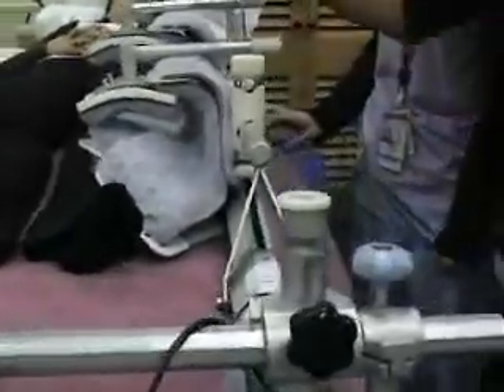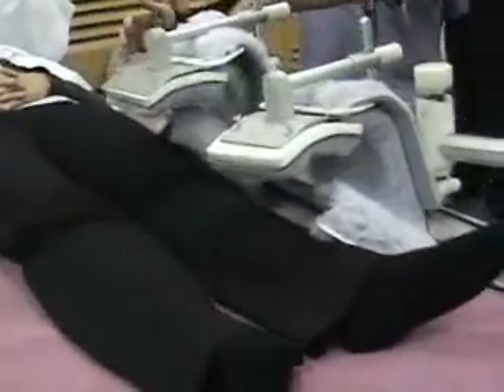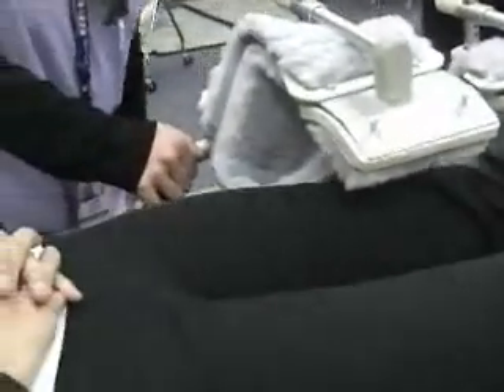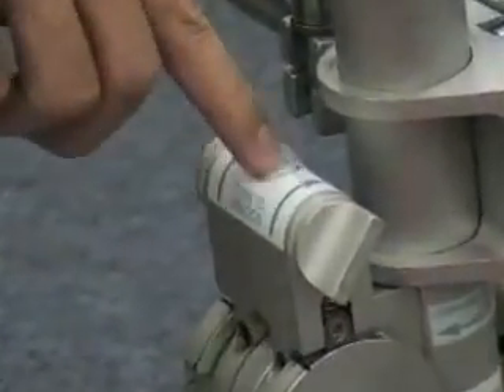You're going to lock the CPM into position. Do that by pressing this one down, watching for the patient's leg — make sure these pedals are not going to hit the patient's leg. Push it down until it snaps back into place. The little knob should be even and depressed. Now you can feel it's not moving out.